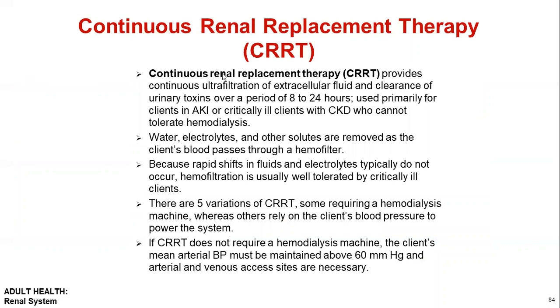Continuous renal replacement therapy provides continuous ultrafiltration of extracellular fluid and cleaning of uremic toxins over a period of 8 to 24 hours, and is used primarily for clients in acute kidney injury or critically ill clients with chronic kidney disease who cannot tolerate hemodialysis or regular dialysis.